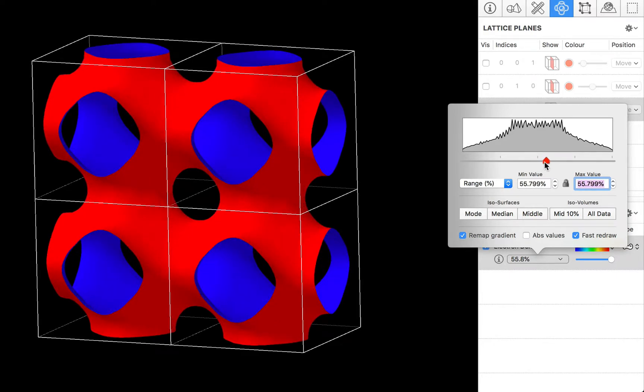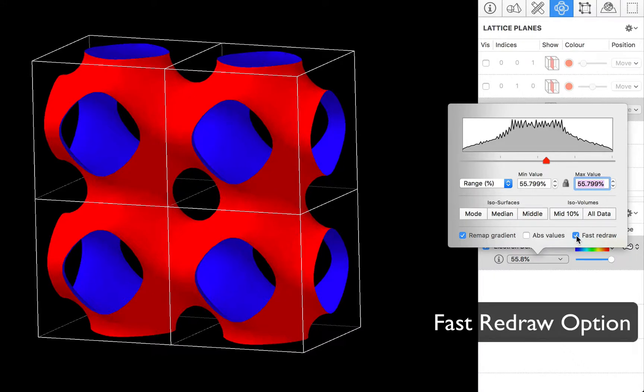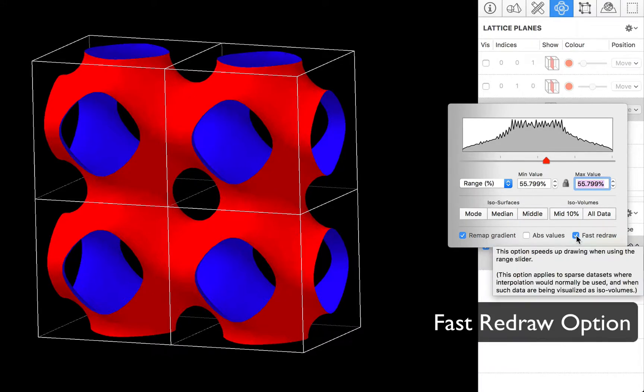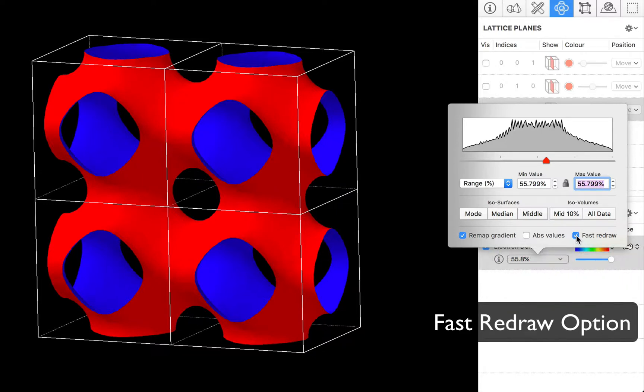Finally I should note that we have the option of a fast redraw. So normally if you have fairly low resolution data CrystalMaker 10 can interpolate values. It actually uses bicubic or tricubic interpolation to give you a nice smooth plot.